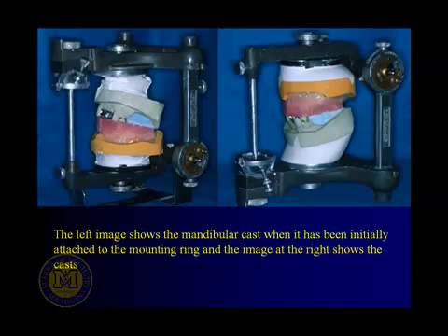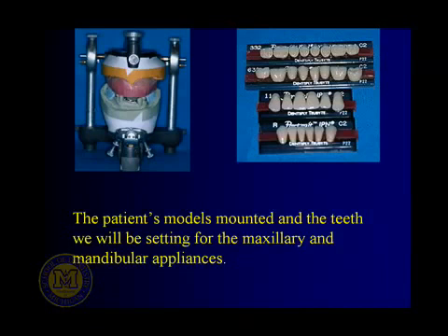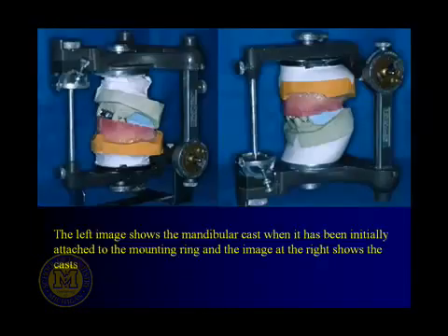If you'll notice, in each of the labs, on the side of the lab that's a little closer to the green clinic, there's this little cable that bolts these certain objects we have in there to the handles of those cabinets up above. There's this little aluminum stand that looks like this funny thing. What's this for? Put that on the table and turn one of these articulators upside down. And this little thing down here may look familiar, because this little thing right here has a hole in it, and it's cabled to the handle of the doors on the upper cabinets.